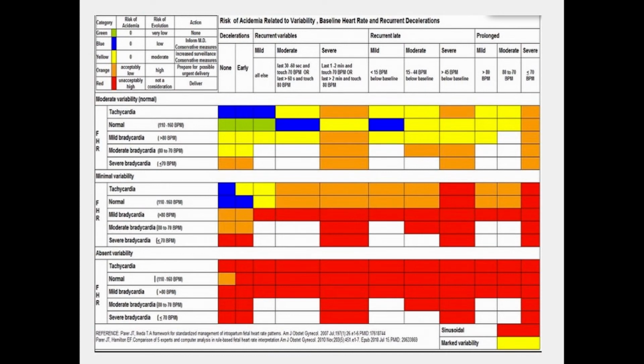And then prolonged decelerations are, because they're prolonged, bradycardia, that's bad. How long can a baby keep perfused with an abnormal or slow heart rate? The answer to that question depends on what the heart rate is. So at 80 beats per minute, we're going to perfuse better than at 40 beats per minute, right? So at 40 beats per minute, if you're seeing a prolonged deceleration that deep, you only have a couple minutes. If the heart rate deceleration is 100 beats per minute, you probably have 8 to 10 minutes because that's not that slow, okay? We have quite a bit of time.